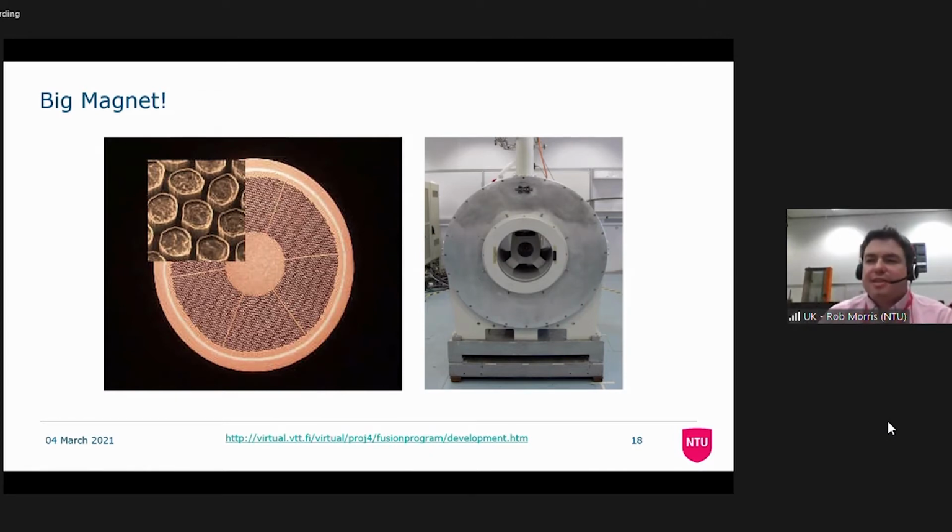And as long as that is supremely cold, we're talking minus 200 and something degrees, so a couple of Kelvin, it will be a superconductor, which means that as long as we want it to do so, it will be a really big magnet. It's a really stable magnet, a really strong magnet, and it will stay a magnet for, in theory, so Siemens say, hundreds of years without needing anything doing to it. But whether or not that will happen remains to be seen.